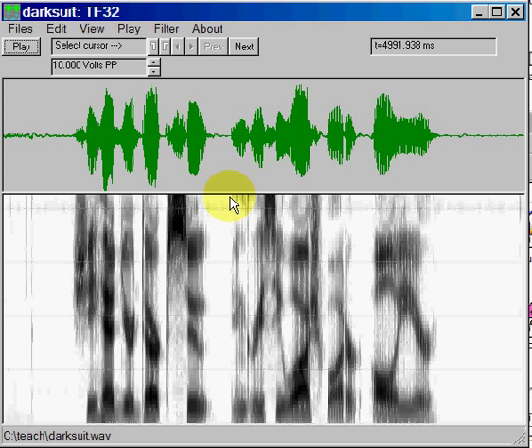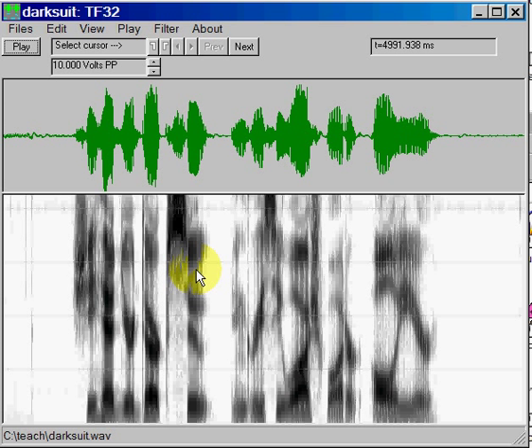There are a number of different display formats that you can use in TF32. For the time being we're going to focus on the sound pressure waveform display, and as a result I'm going to close the spectrogram display.